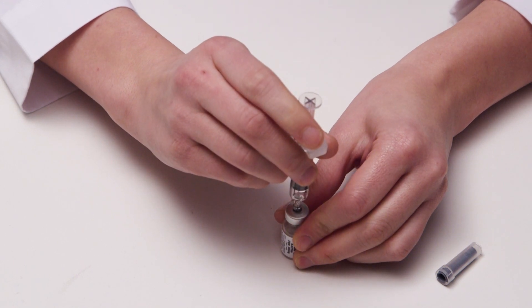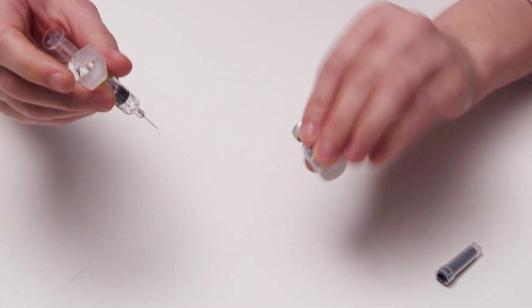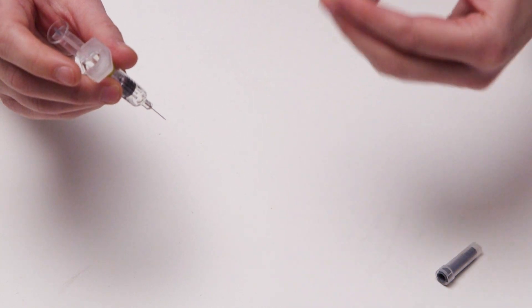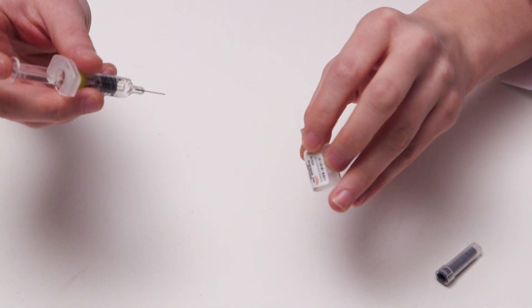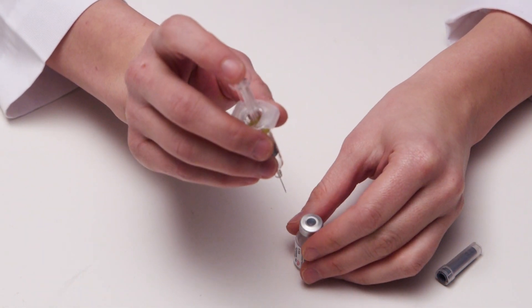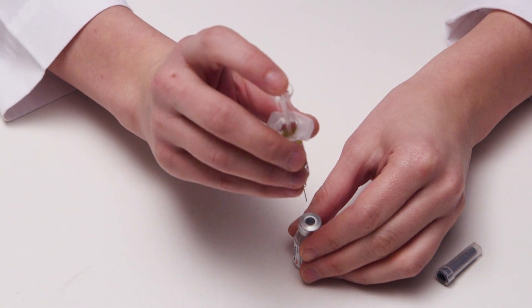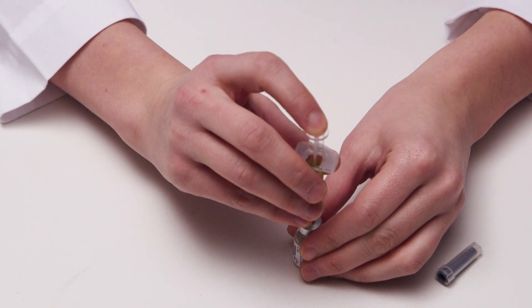Remove the syringe and gently mix the powder into the liquid. Once it's thoroughly mixed together, insert the syringe again and turn both the syringe and vial upside down so that the vial is on top.